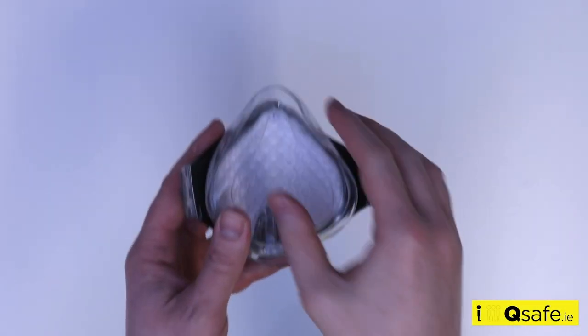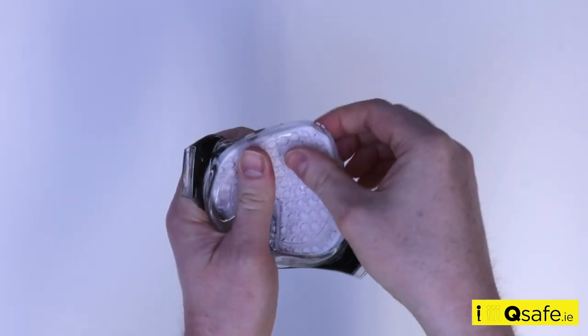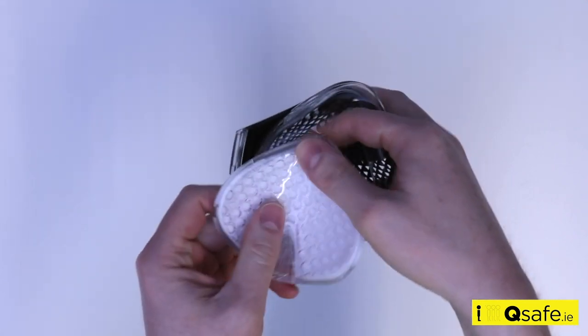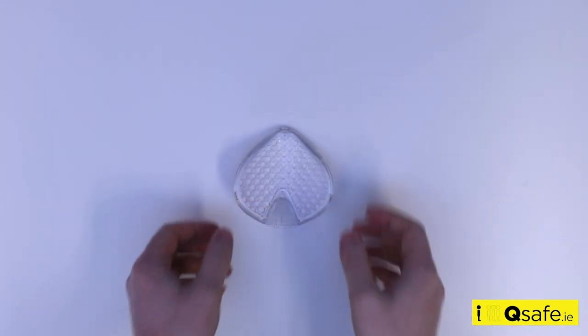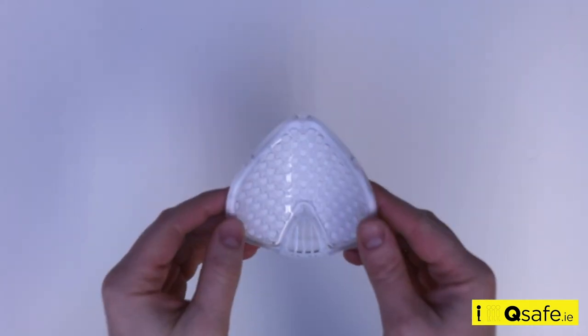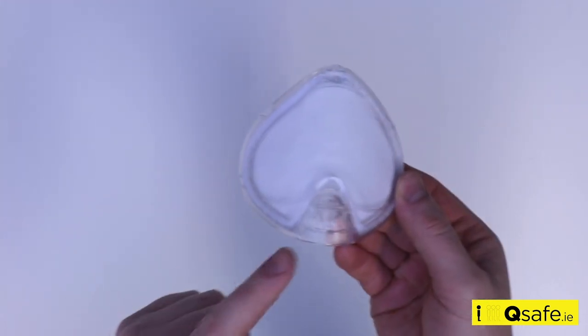The silicone mask is quite stretchy. You can easily peel back the silicone face mask to remove the filter. Once the filter housing has been removed from the mask, to open it slide the locking tab down.